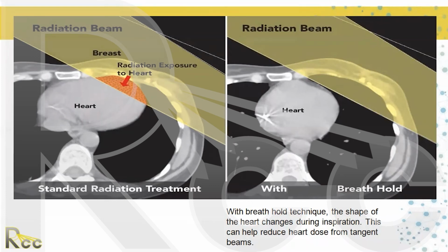In 3D conformal RT, some Linacs have multileaf collimators, but the tumor is not well shaped. Can you give reasons for this? Yeah, well, tumors come in all different shapes, and they have all different clinical spreads to them too. So it's hard to really define an exact tumor shape that's the same. They're not the same. They're very different.